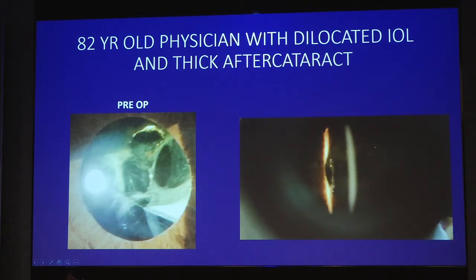So here is an example of an 82-year-old physician who had a lens implant done by a good friend of mine. He had 6/9 vision through a small zone there, but he wanted to read the Hindu and the whole lancets. So he wanted to have better vision. So I did cataract surgery in the fellow eye, because the fellow eye had a simple cataract. But then after the fellow eye was done, he still wanted something to be done for this eye.